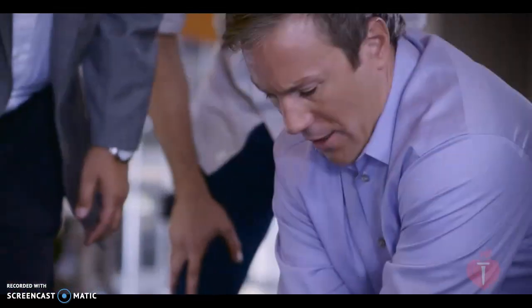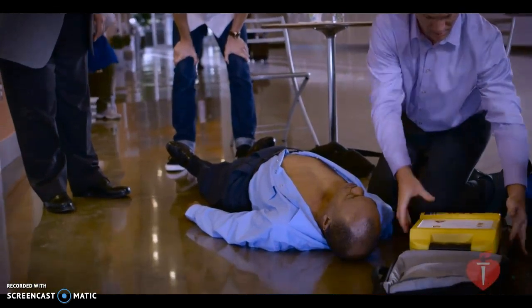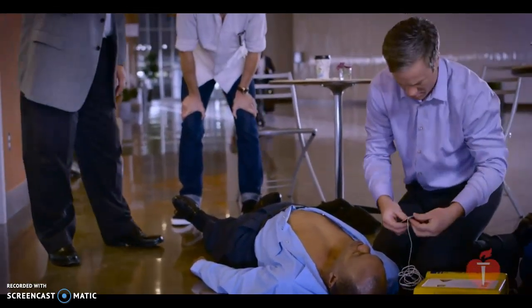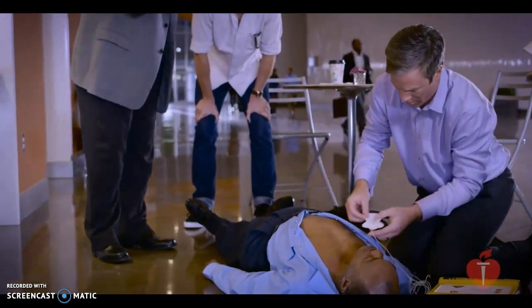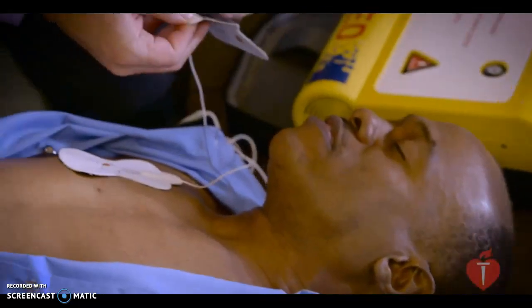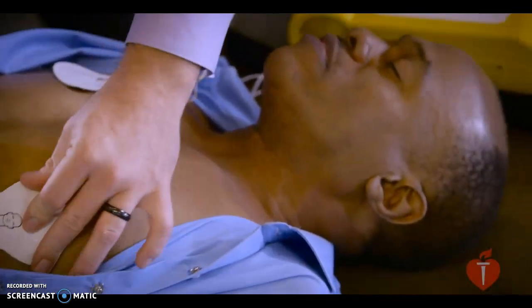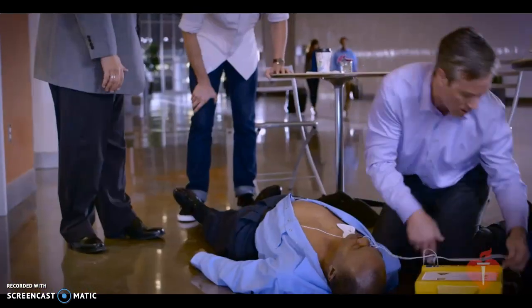28, 29, 30. I got the AED, but I don't know how to use it. I don't know if I can answer all of your questions, so I'm going to put you on speaker mode and put the phone next to the man who's helping him. This is the dispatcher. Can you hear me? We have an AED. I'm attaching pads now. Yes, I can hear you. Plug in pads connector.